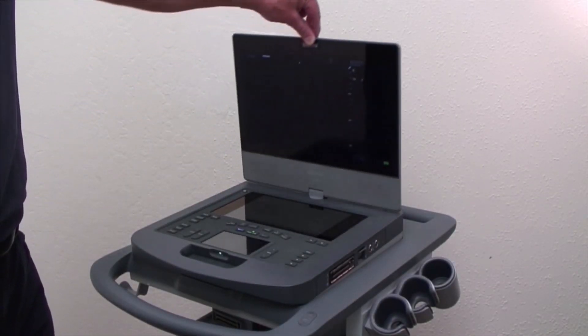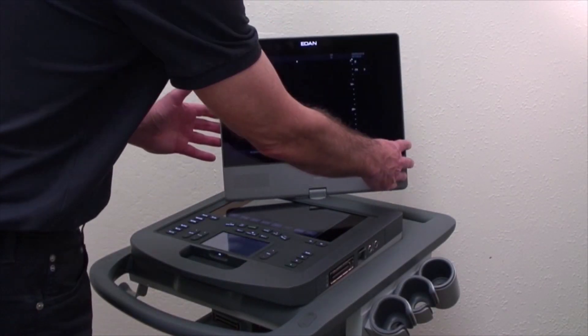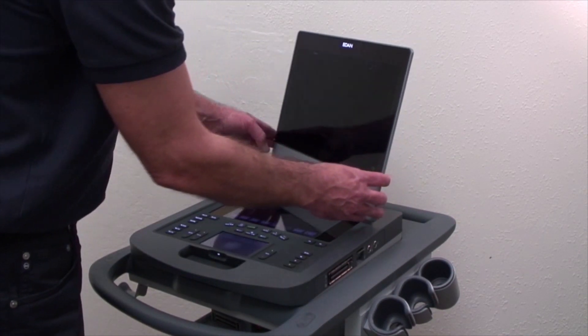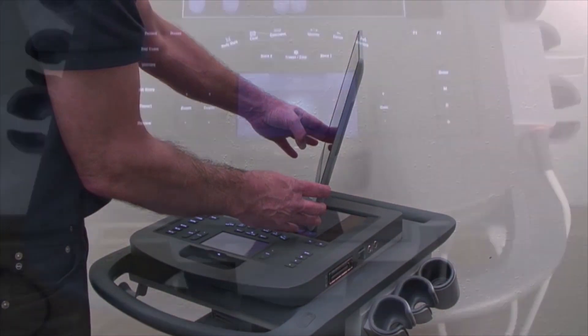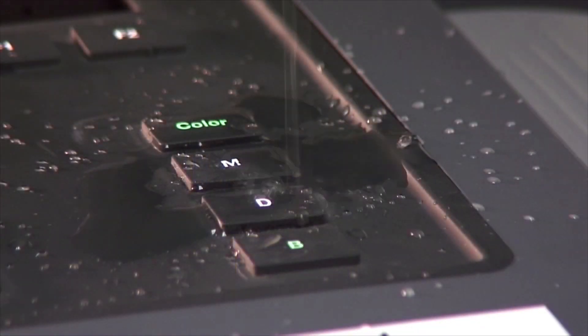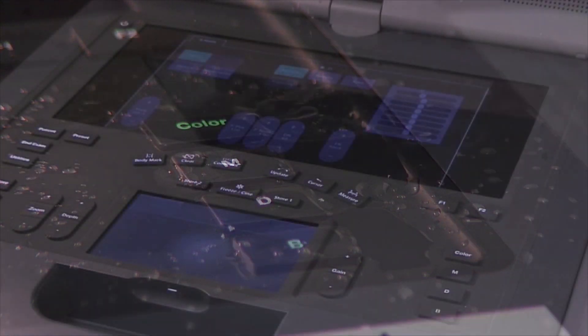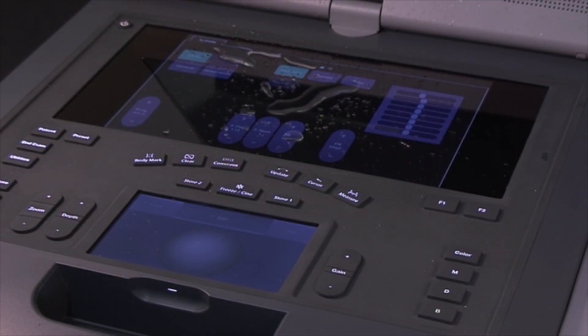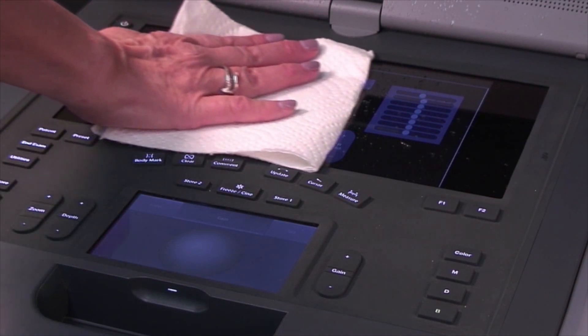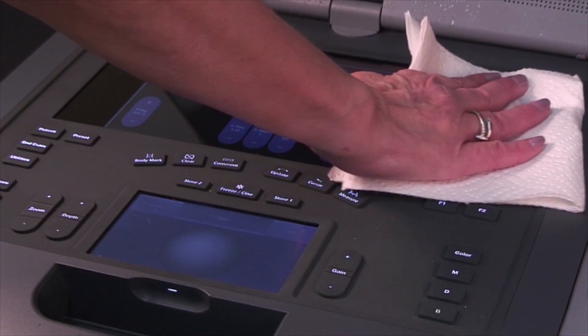The 15-inch high-definition monitor pivots and angles for maximum user comfort and clear screen visualization during procedures. The control panel is completely sealed, incorporating dual touchscreen panels. We've eliminated the trackball and other hard keys where dirt and gel can collect, making the system easy to clean and aiding in disinfection.